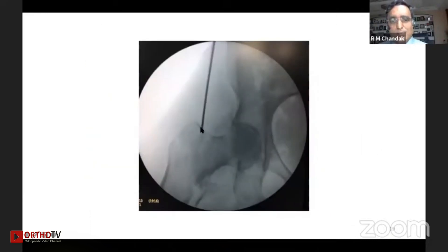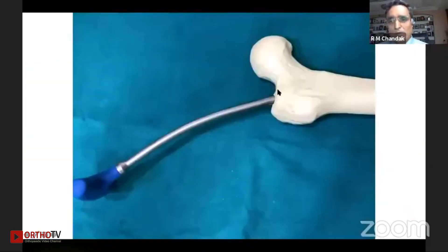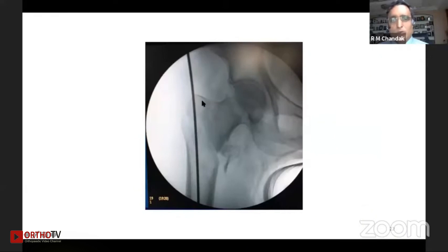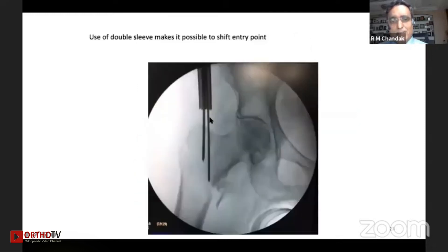This is a drilling pin applied, and on the drilling pin a sharp awl — this is from a TFN set — works very well. It has a sharp edge which cuts very well, so you can core on the inner side or on the outer side as needed. A gentle curve helps to guide and change the tract of the guide wire. Most of the time if there is a fracture line, the guide wire may track out, so using this curve is helpful. Here the entry point is seen to be slightly lateralizing, so we shift it anteriorly and medially.